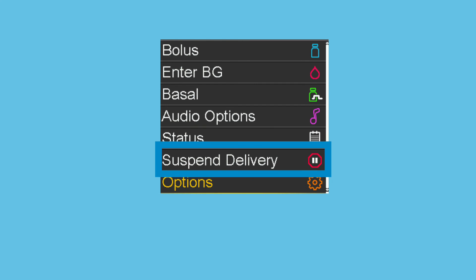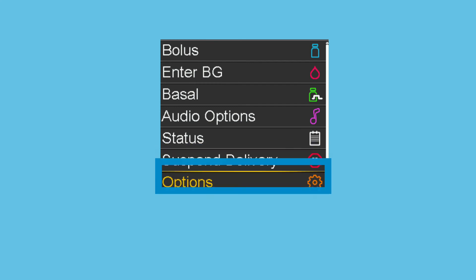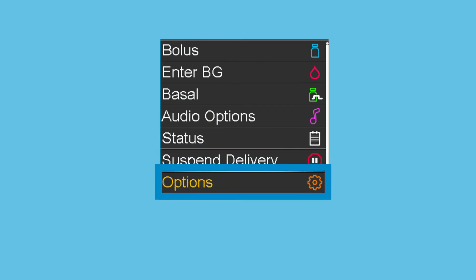Suspend Delivery stops all insulin delivery. Typically, this option is used when disconnecting from the pump to swim or bathe. Options gives access to the SmartGuard features, history, reservoir and tubing, delivery settings, event markers, reminders, and the utilities menu.